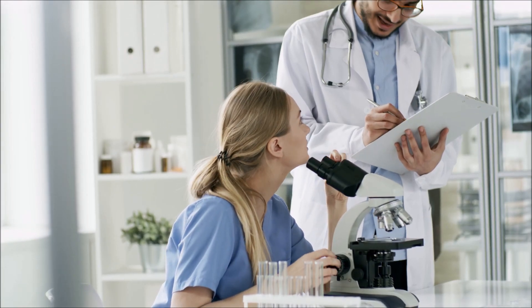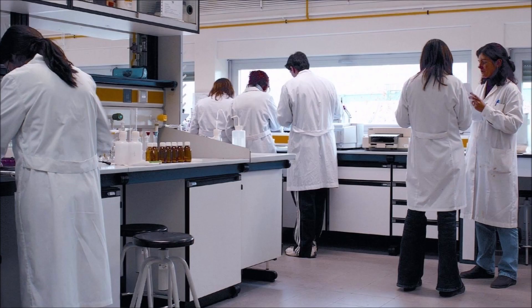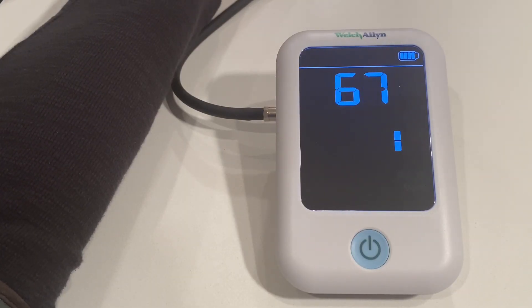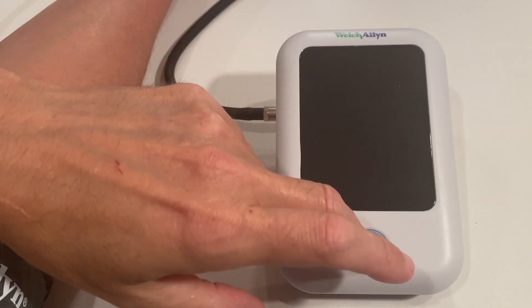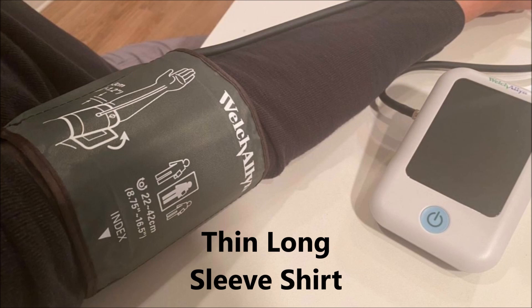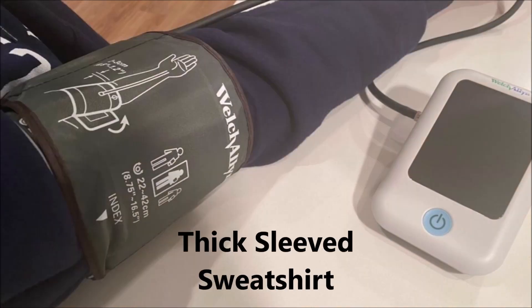First, I'm going to let you know what the studies and experts have to say. And then I'm conducting my own blood pressure experiment, measuring my pressure three times: once on bare skin with short sleeves, a second time with a thin long sleeve shirt, and a third time with a thicker sweatshirt sleeve.